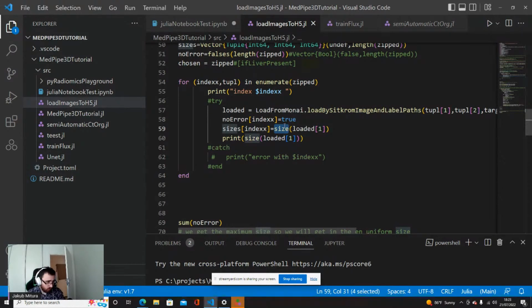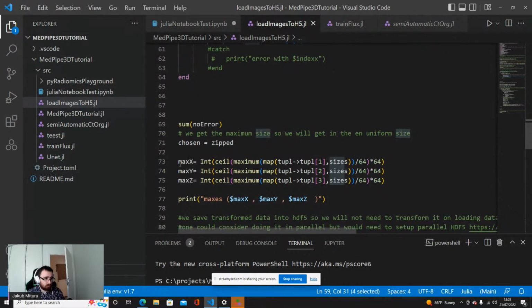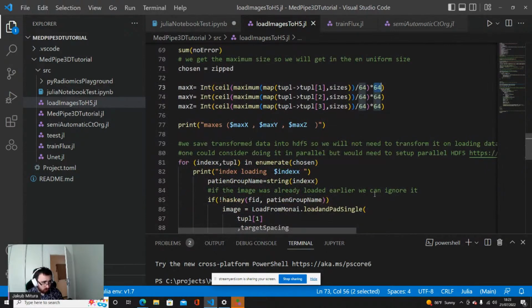And then we are choosing the maximum x, y, and z dimensions in order to pad the whole image to the required dimensions. We also want it to be divisible by some numbers, like 64, for example, because of the U-Net architecture. I will show you in a moment in an image how it works.